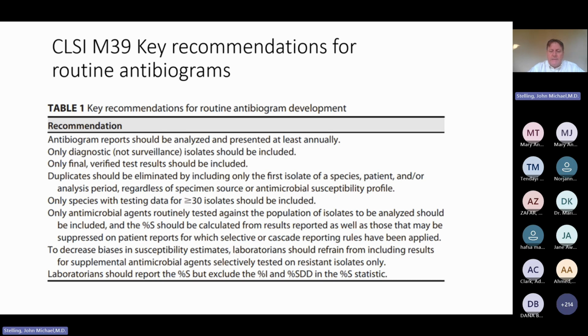I'll come back again to this issue of bias. The issue is not only how many isolates. If you have 32 isolates, great, that meets this criteria. But if you have 200 isolates, that sounds like a lot, except they might be very biased. I'll talk later about the difference between accuracy and precision. I can tell you that today I am currently 26 years old, 5 months, 2 days, and 4 hours.